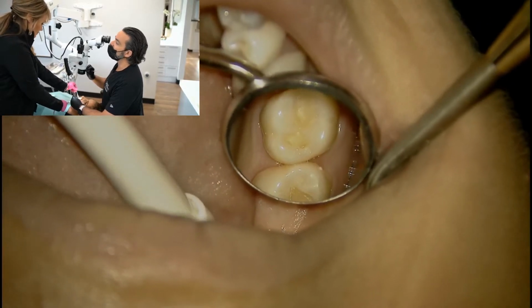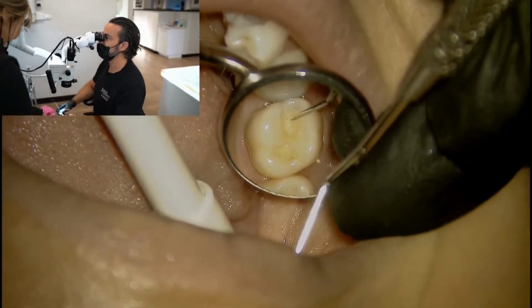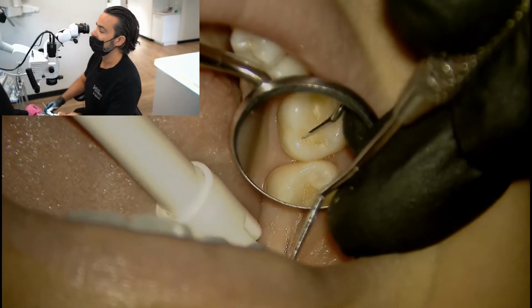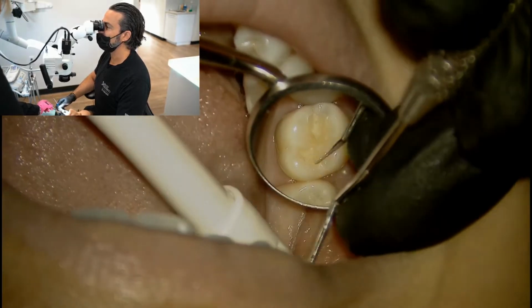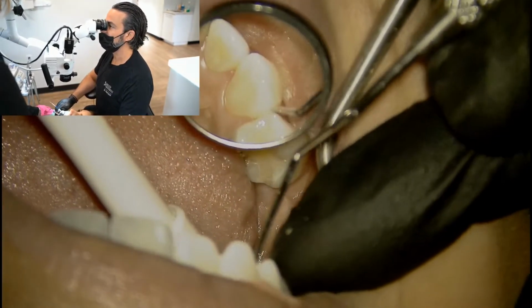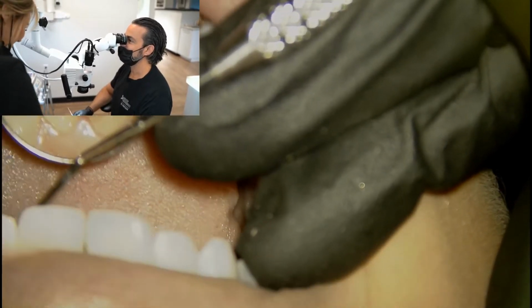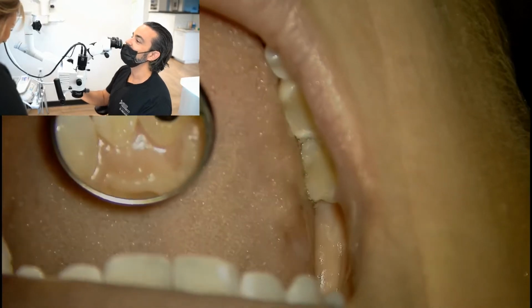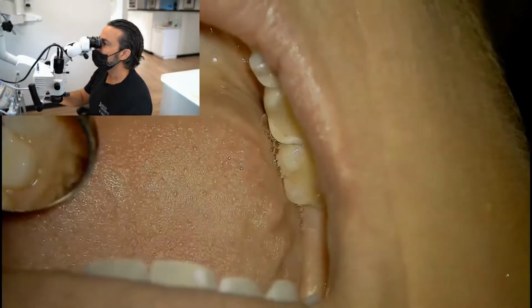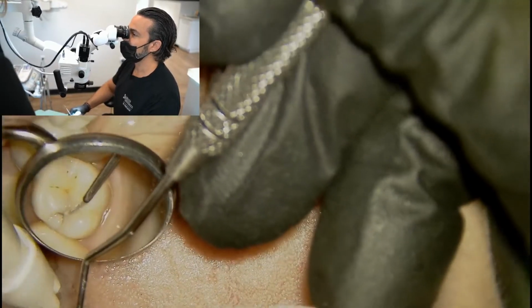Can we turn down the brightness on that screen a little bit? Actually, I'm finding some defects worth fixing here, Miss Lindsay. So, looks like we want to do a little bit of repair work here. Don't you guys worry, I have informed consent going on here. She works for me. Her dentistry's gonna be for free. So I'm just gently, as you watch me, looking around the mouth, identifying some problem areas.